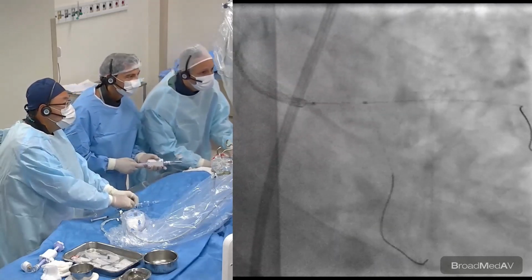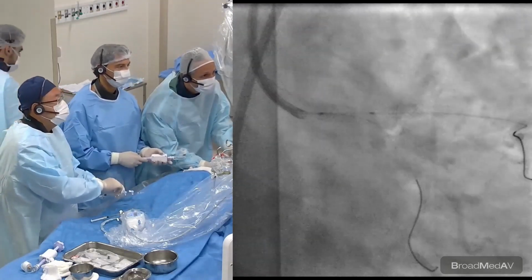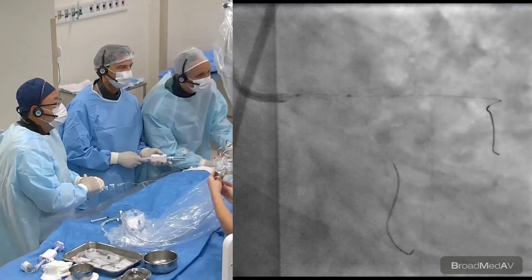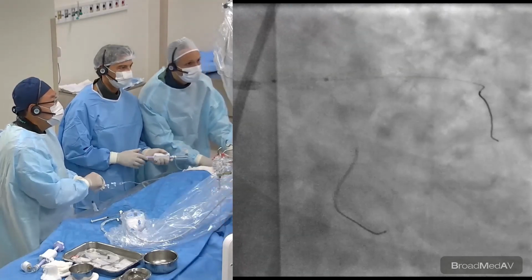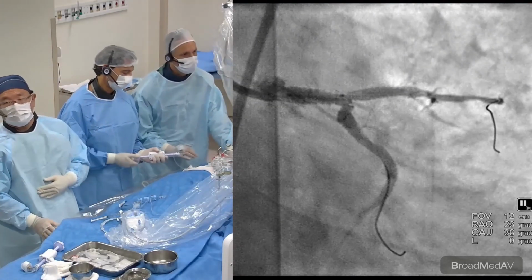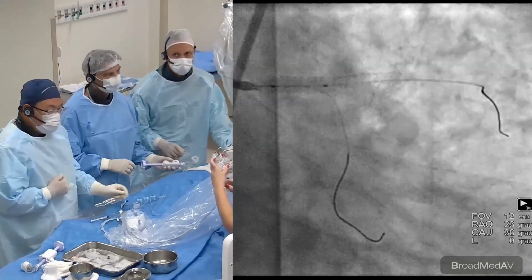Now we're gonna go back, go forward a little bit. Test. You want to record? I think it's good. Hold on, I think we need to show this. I like this position better. Okay, let's go here. How much pressure? So 20 atmospheres also. I think we just optimize it where we need to be. Great.